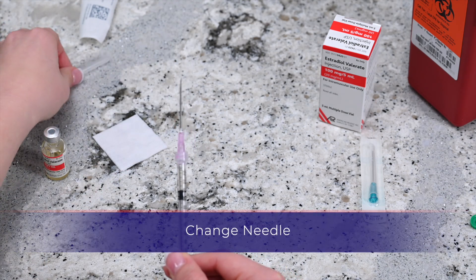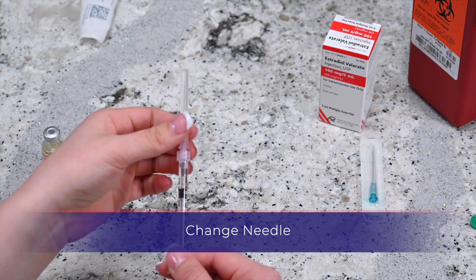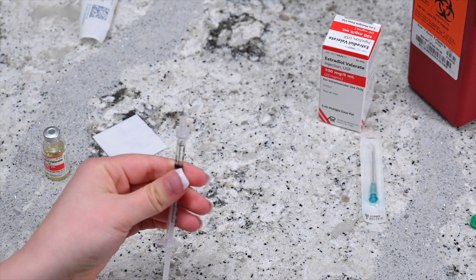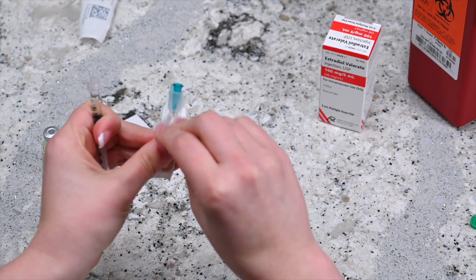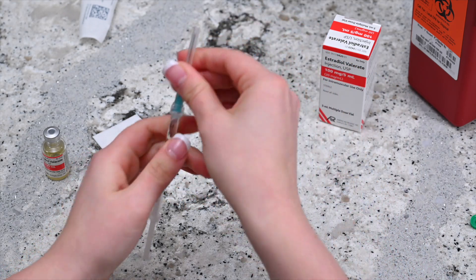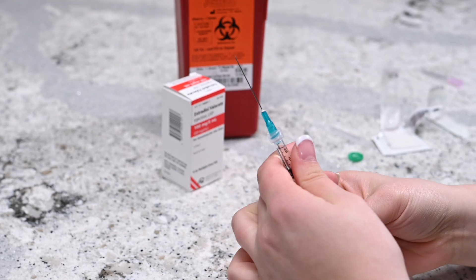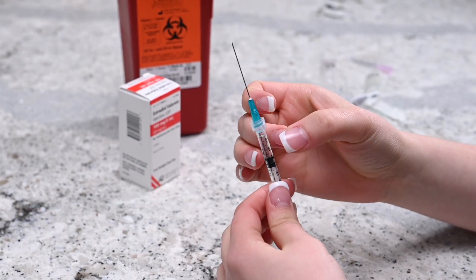Twist off the needle and place it in the designated sharps container. Remove the 22 or 23 gauge needle from the packaging and twist it onto the syringe. Hold the needle upright and remove the cap — do not let the needle touch anything, including your hands. Still holding the needle upright, gently tap the side of the syringe until the air bubbles migrate to the top.